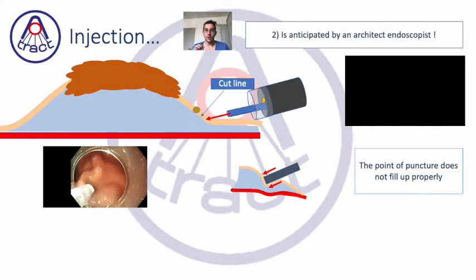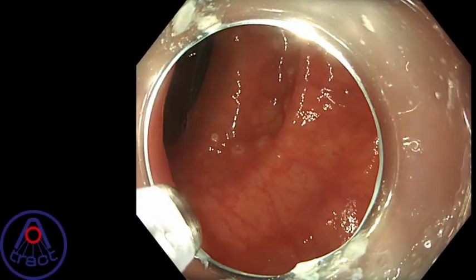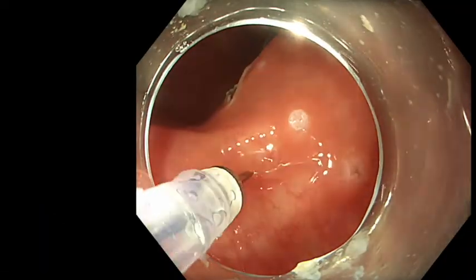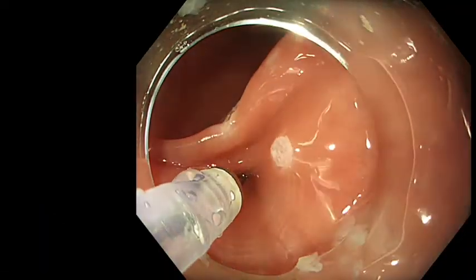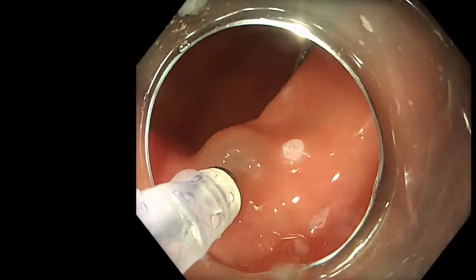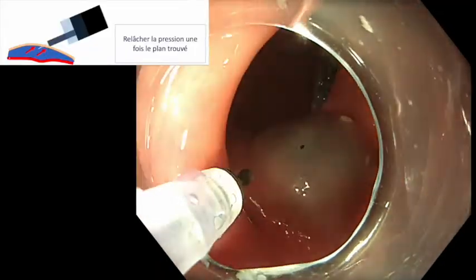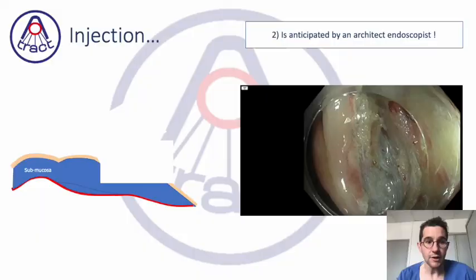So please think of it: push to get the layer, and after, remove your device in order to let the area elevate, and not push it, to reduce the filling by the fluid into this area.